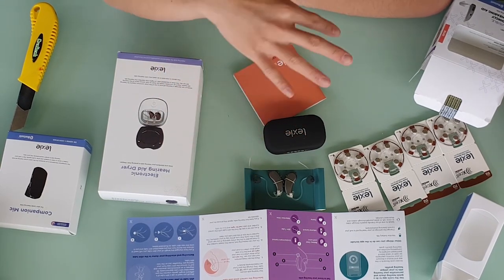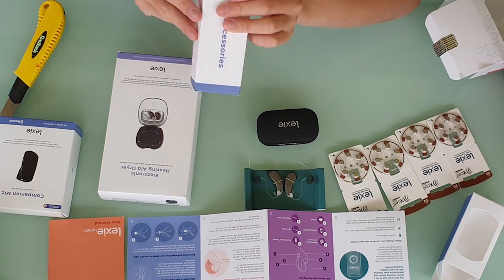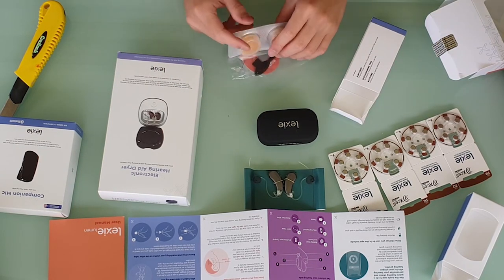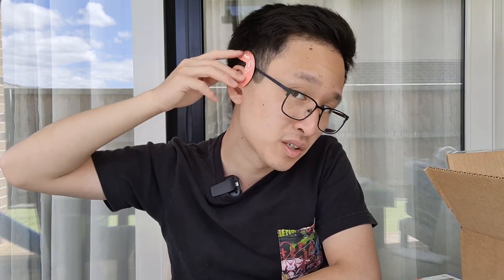So if you download the app, they will also step you through the whole process. And there's a little accessories kit, which comes with slim tubes, an ear measuring tool, and some batteries. They've also got some silica gel to keep your hearing aids nice and dry, a cleaning brush, a wax pick, an ear measuring tool to make sure you've selected the right tube size, and some extra domes.